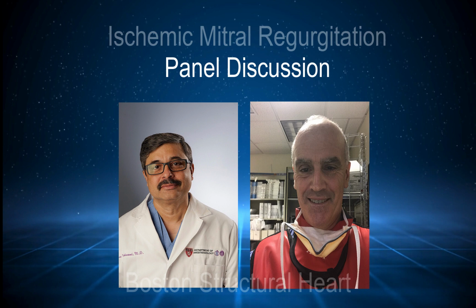Wouldn't ignore the mitral valve regurgitation. It would certainly be part of your assessment, but I don't see anything here that means that you should replace this valve. I meant repair also. Do you think so? I don't see any need that you should do anything to this valve at this time. So the reason I'm asking this thing is that fortunately this patient has high-grade proximal stenosis, which means that possibly he doesn't have microvascular disease, which means it's likely to respond to purely an anti-ischemic therapy of revascularization.